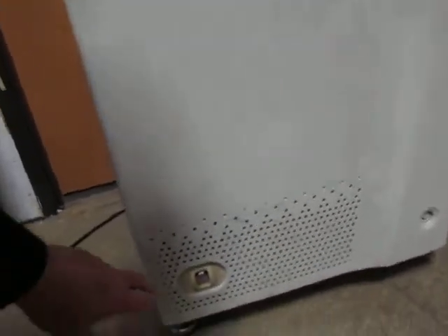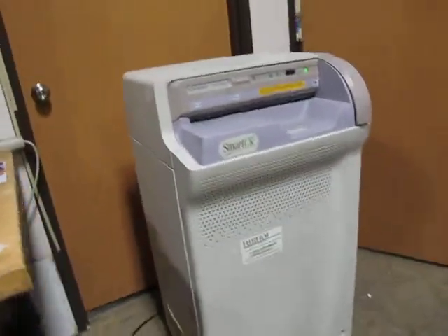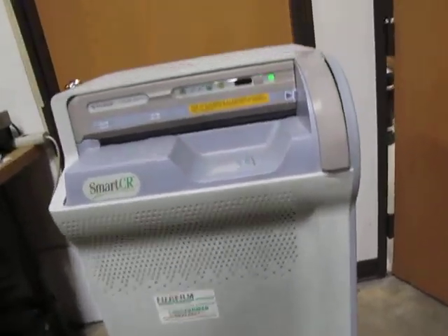I just figured I'd make a video. I'll turn this thing on — it's a 110 unit. You can hear the fan running, and this thing turns green.